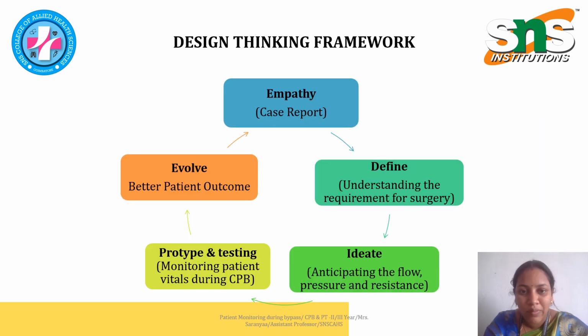So this is a design thinking framework which explains this case scenario in a simple way. Empathy is the case report, what you have seen today, and define: you have to understand the case. What is this? It is a mitral valve repair. Understanding the requirement of surgery: the patient needs an exact placement of all the equipment needed, and the blood flow has to be calculated. Ideate means what anticipated problems, or anticipated flow and pressure resistance, you want to monitor, and you want to sort out the problem and have a smooth bypass. Prototype and testing is about monitoring of the patient vitals during CPB, and evolve is the end of the case, that is, a better outcome of the patient.